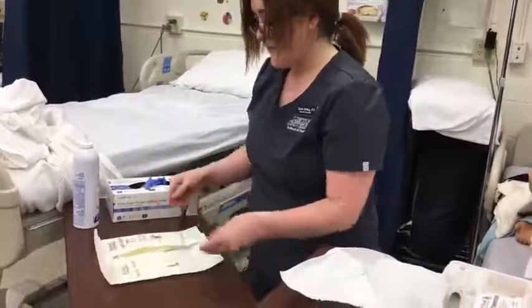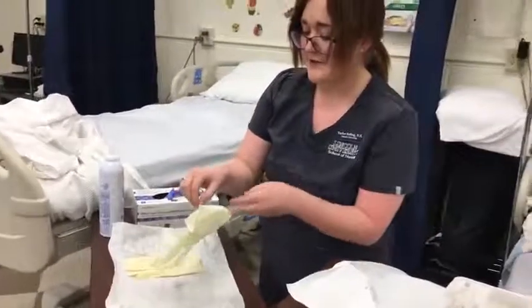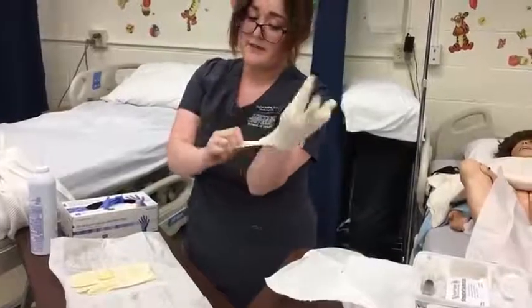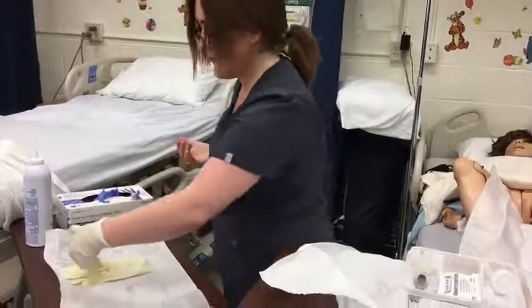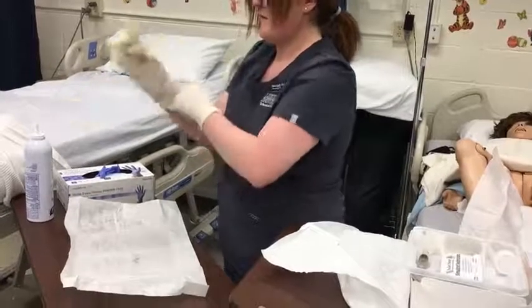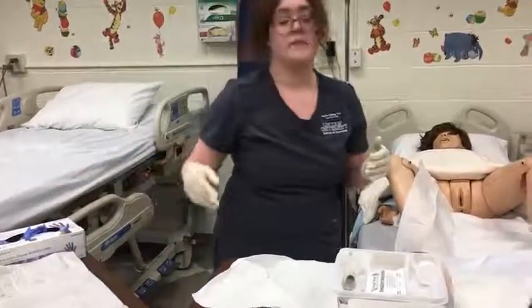We have the same concept here for sterile, using that 1-inch border that I have. For sterile gloves, you want to glove your non-dominant hand first. Make sure you only touch the inside of the glove because your other hand is not sterile yet. If my gloves rolled like this, I would get a new pair, but for this video, I'm just going to continue. I reach inside the glove, and got it. Again, if my gloves rolled this way, I would just get new gloves. All right, I can take that and throw it away if I want.